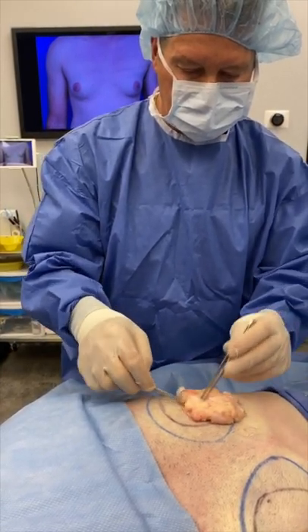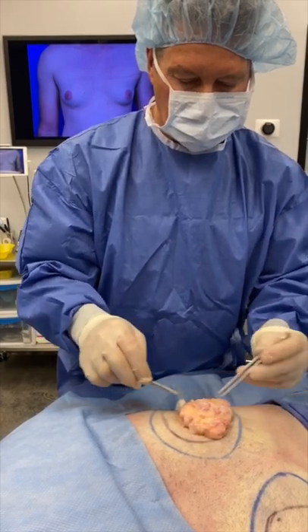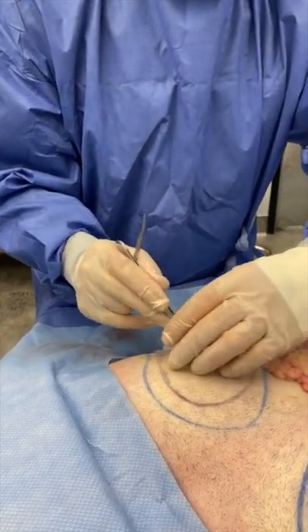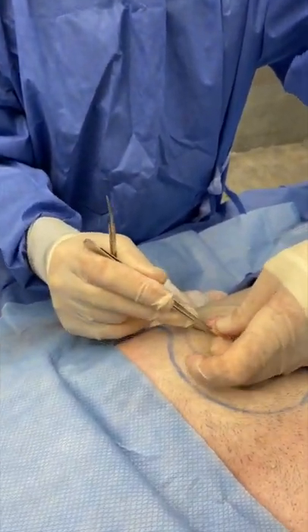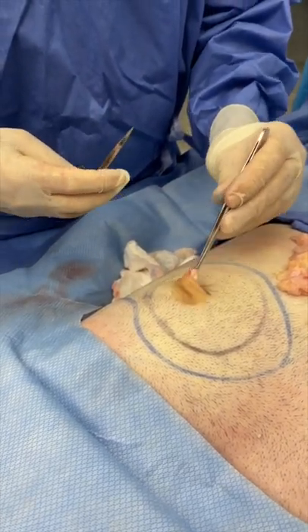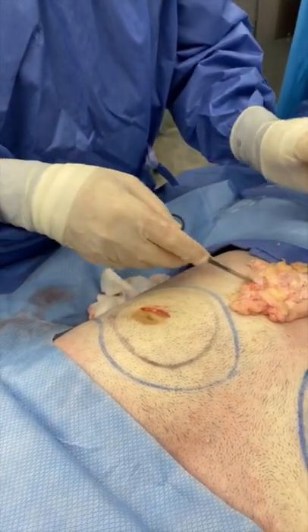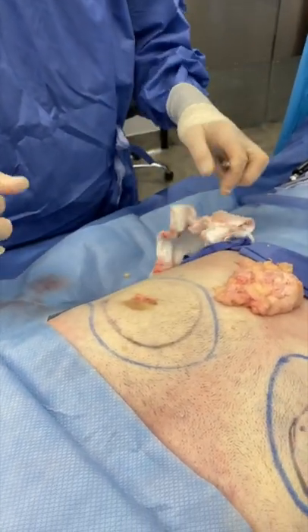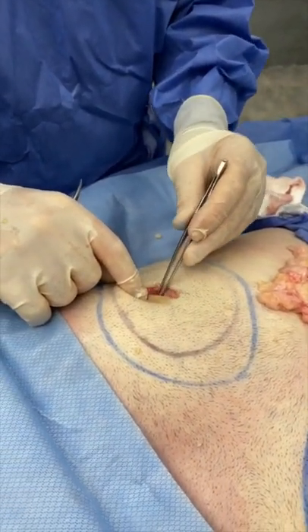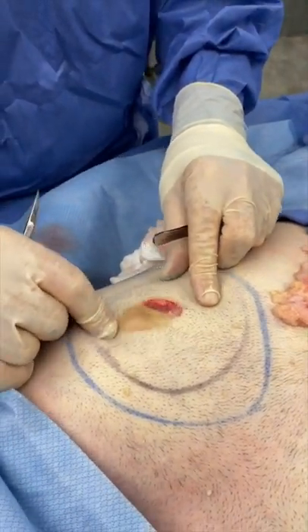This is the underside that was stuck to the prepectoral fascia. Complete removal — there is nothing below the areola now, that's just dermis. Any residual tissue is removed. You can appreciate the exposure of the muscle and the defect that's created.